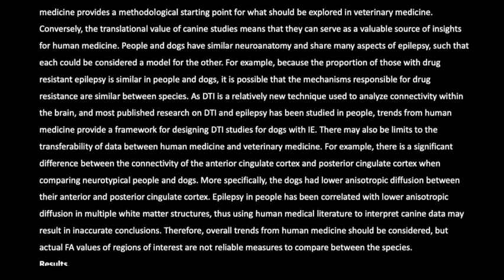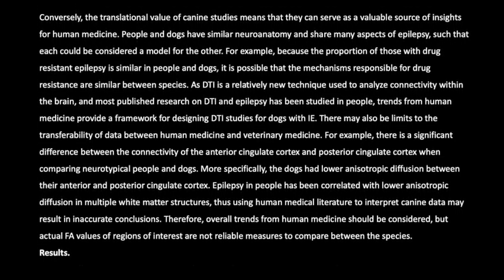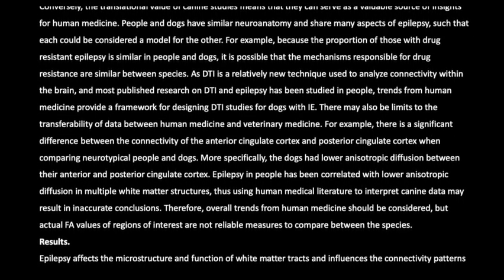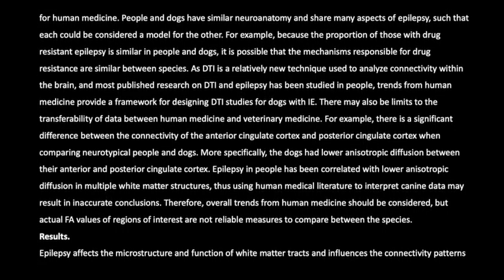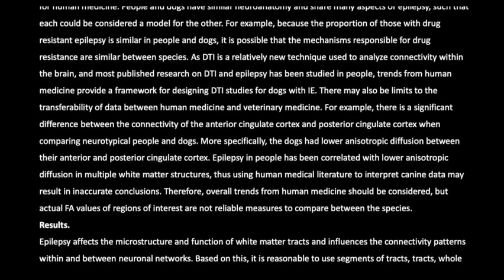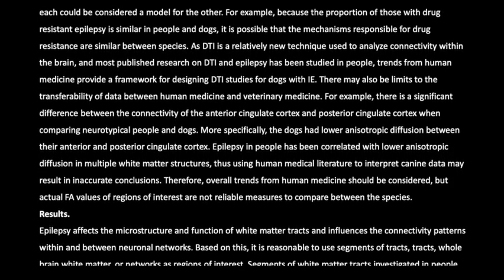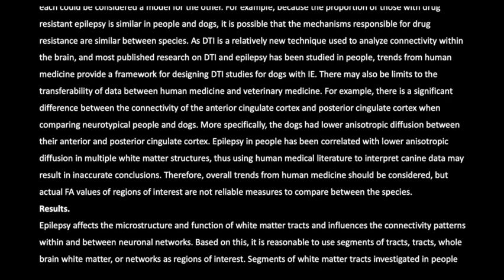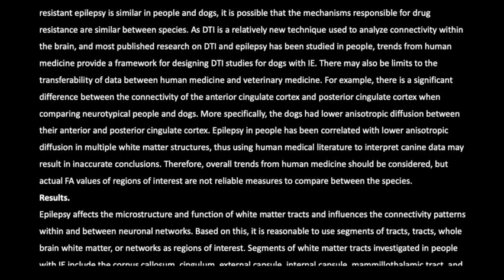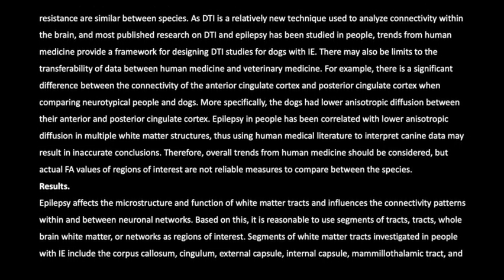As DTI is a relatively new technique used to analyze connectivity within the brain, and most published research on DTI and epilepsy has been studied in people, trends from human medicine provide a framework for designing DTI studies for dogs with IE. There may also be limits to the transferability of data between human medicine and veterinary medicine. For example, there is a significant difference between the connectivity of the anterior cingulate cortex and posterior cingulate cortex when comparing neurotypical people and dogs.